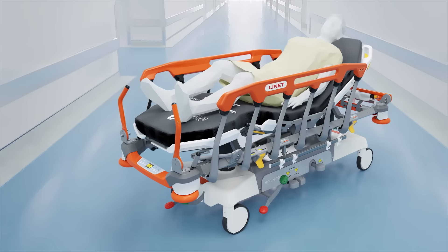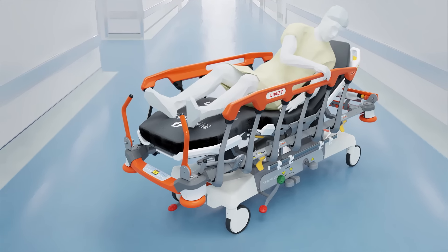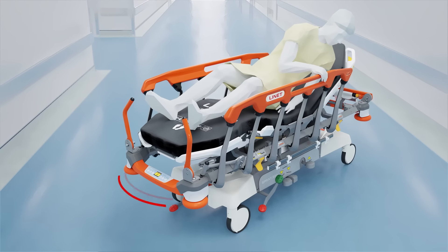Caregivers cannot be everywhere. To prevent falls, the multi-zone bed exit feature warns them even when patients try to leave the stretcher unattended.